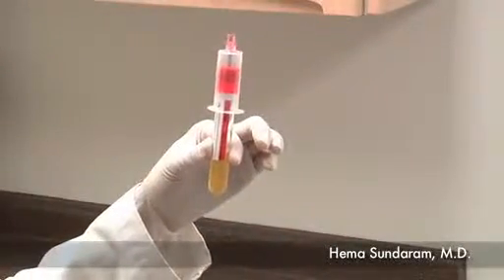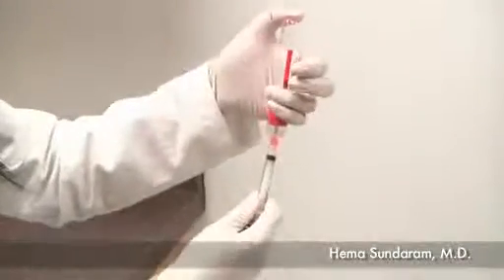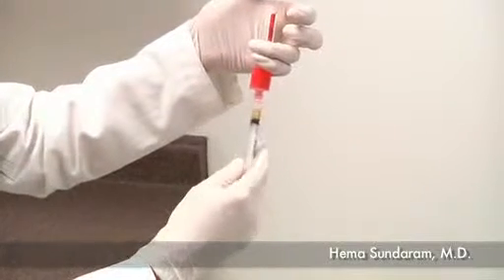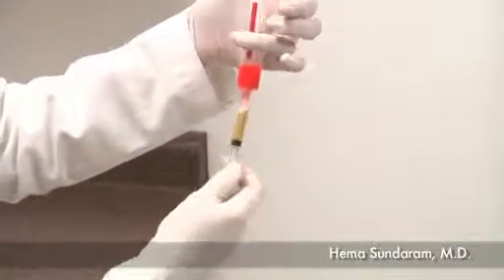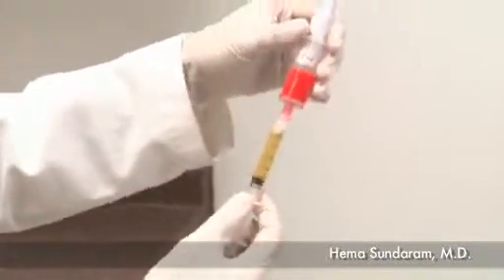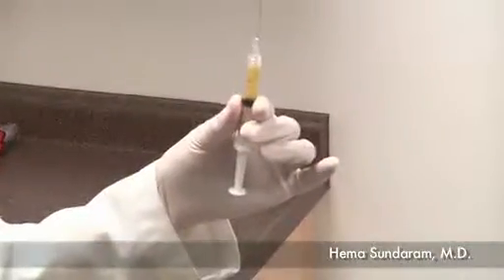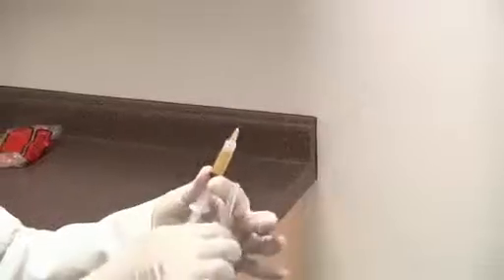We now have 10 minutes to inject the platelet-rich fibrin matrix. The platelet-rich fibrin matrix should be immediately drawn into the syringes. I'm now going to take a 27 gauge 38 millimeter blunt cannula and attach it to this syringe.